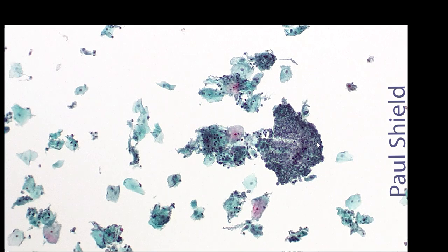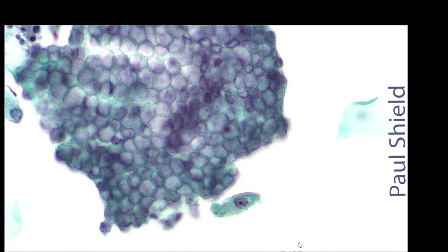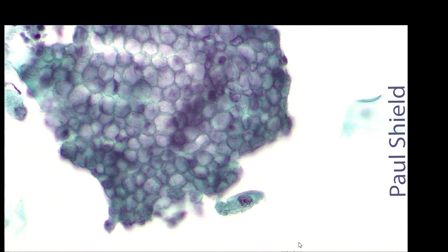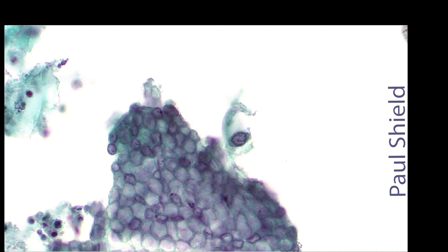Here we go on low power. It's a different case. Hopefully you can recognise by now what those might be. Even in this power, I think I can see that they're all in focus at once, and they have quite an organised, orderly honeycomb pattern to them. This group over there, however, looks different. So we'll look at these. I can bring up a honeycomb pattern quite nicely if I focus down off the nuclei. Notice they're all keeping their own distance from each other, and they're very orderly.